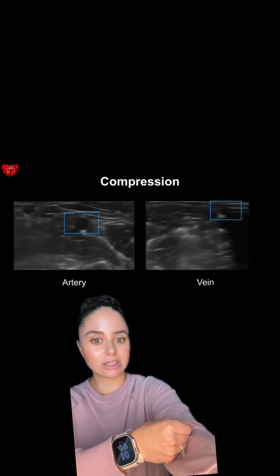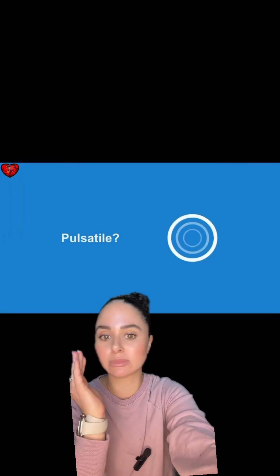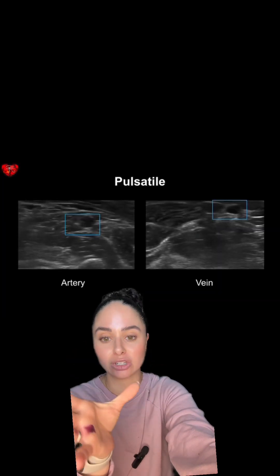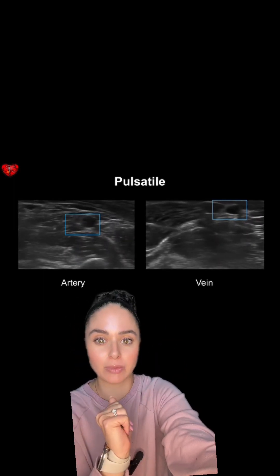I also like to trace the vein up to find which way it goes. Some veins are really wiggly, some are straight shooters, and some bifurcate into different veins. So I like to make sure that I'm going to have a straight shooting path, so to speak.